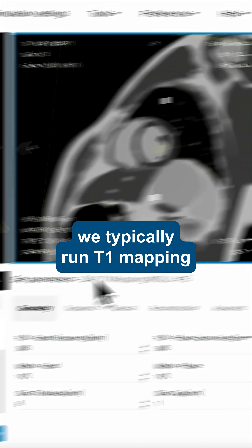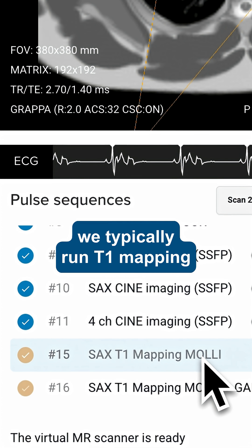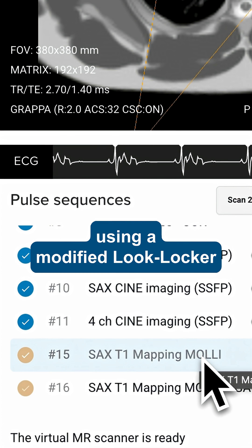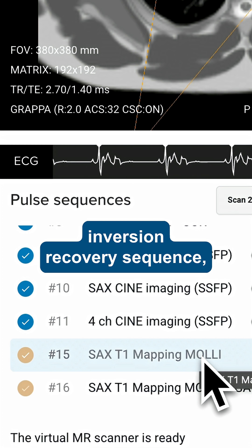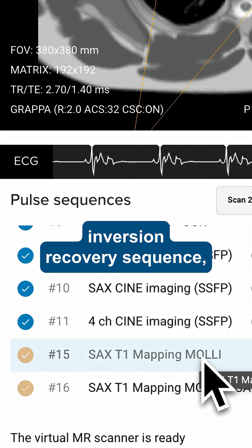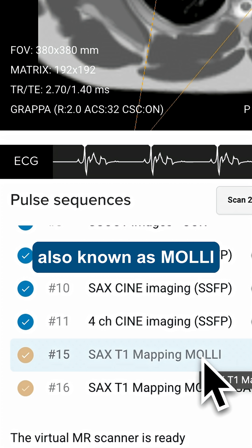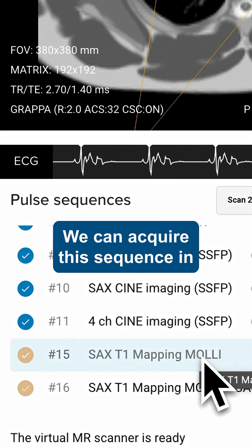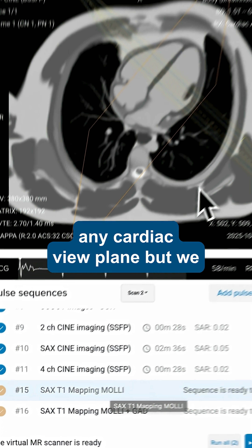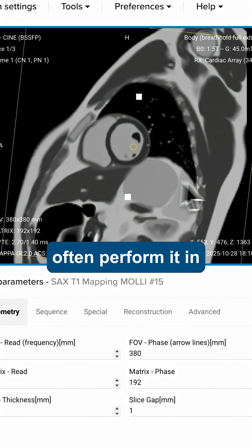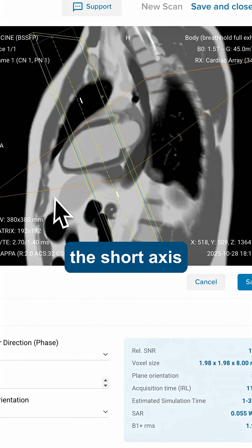In cardiac imaging, we typically run T1 mapping using a modified look-locker inversion recovery sequence, also known as MOLLI. We can acquire this sequence in any cardiac viewplane, but we often perform it in the short axis.